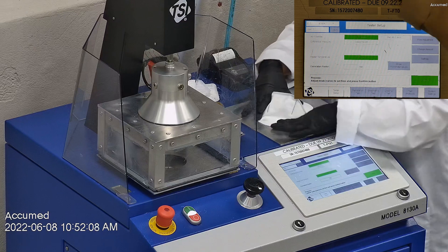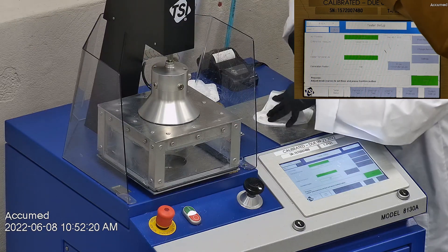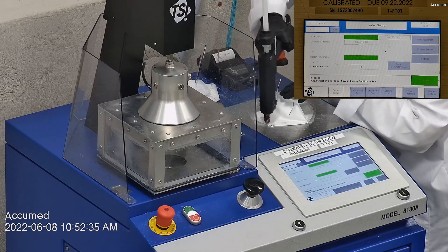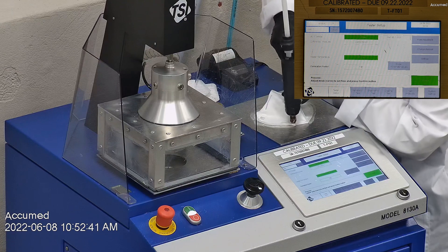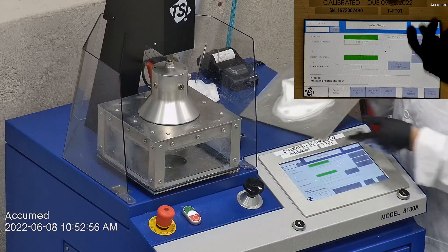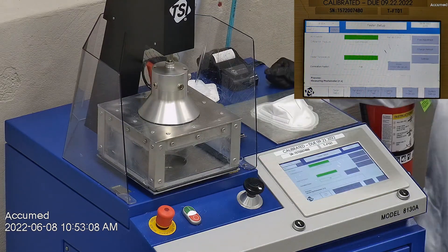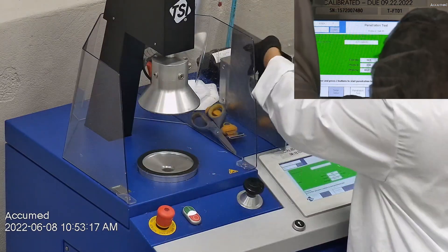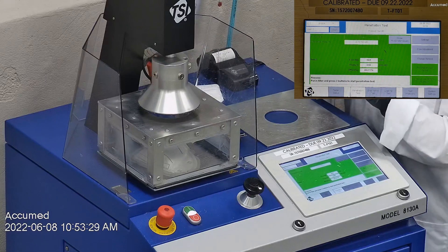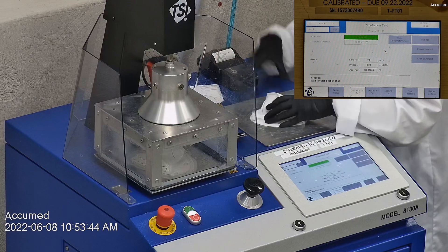We make sure that the mask is properly and completely sealed with hot glue to the testing plate. When applying the hot melt glue, we make sure there are no holes or leakage around the seal to ensure accurate results. The testing plate is then attached to the frame and placed under the TSI holder for testing. On the TSI monitor: F stands for airflow rate, which we test at 85 liters per minute; R is for resistance, also referred to as pressure drop, which correlates with breathability — the lower the number, the more breathable; and E stands for filtration efficiency percentage.